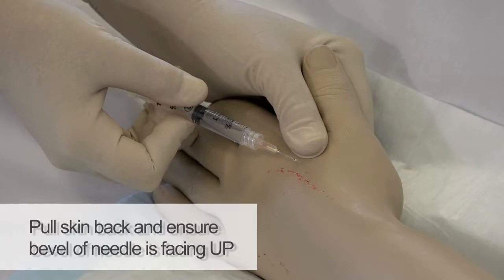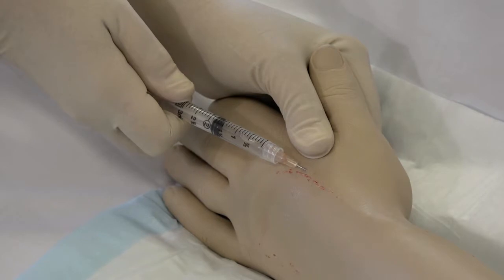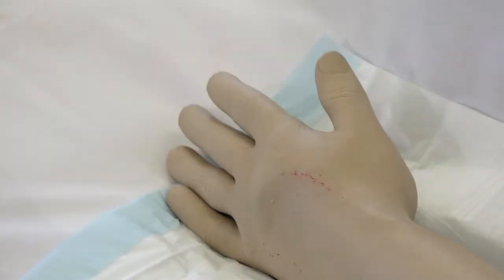Inject lignocaine superficially into the skin and administer approximately 0.1 of a ml until a small bump appears. Release the skin; the anaesthetised area will now sit over the top of the vein.